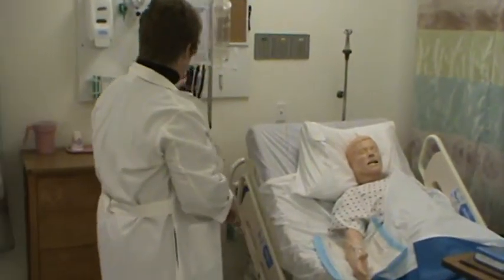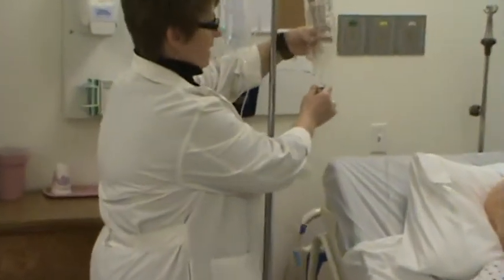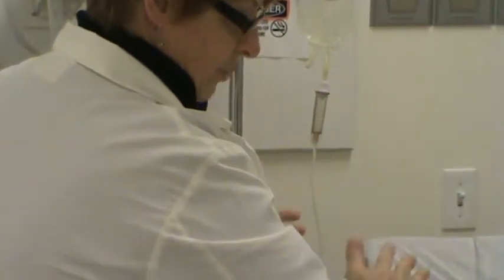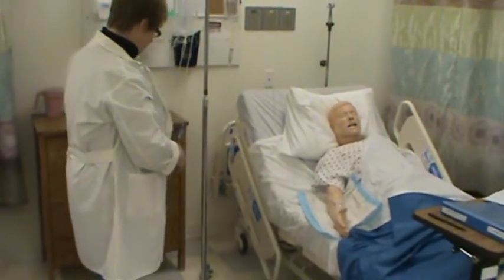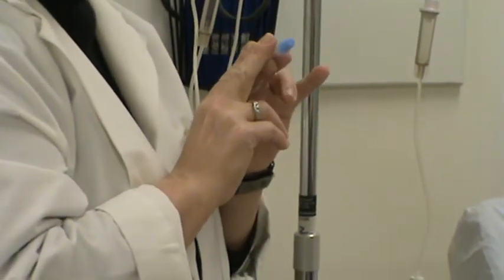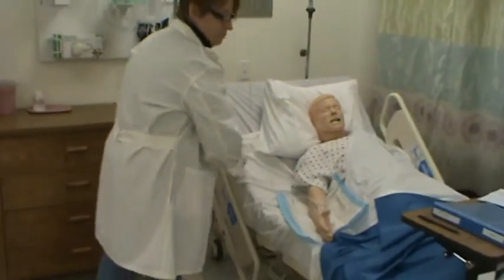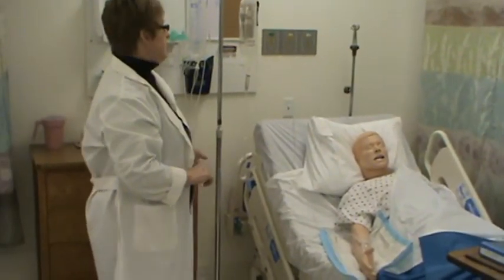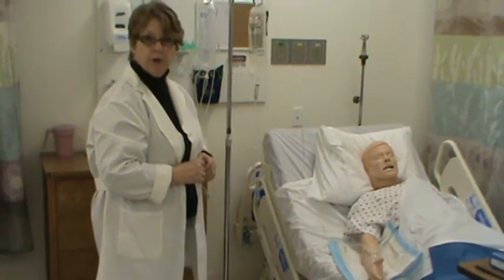take the tube. You'll see that there's some dummy tubing. See, this is empty. So is the tubing. It's just hooked up to our mannequin. And what you'll need to do is demonstrate changing tubing without contaminating the end of the clean or the new tubing into the port that's there. So that's really what's going to happen here. Go through it for you.